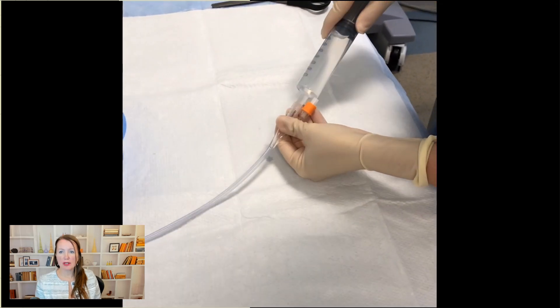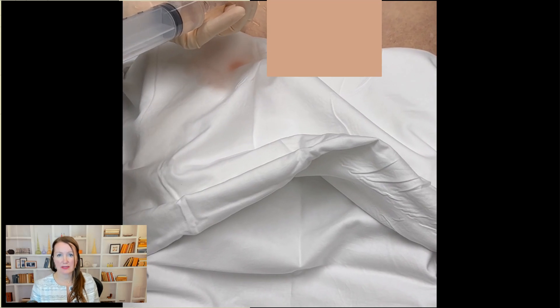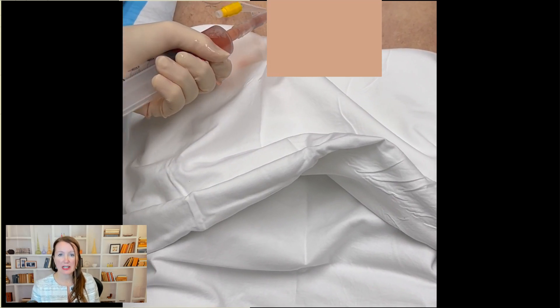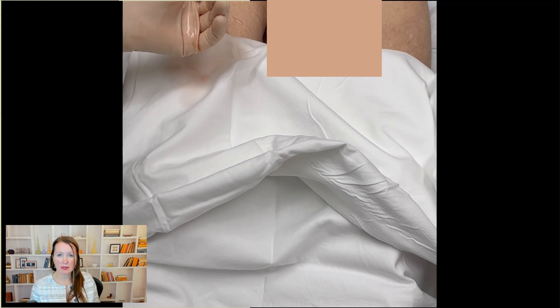To irrigate, sterile water or saline is placed in the syringe and used to fill the bladder. Pull back first to make sure the bladder is as empty as it can be, then push two fresh syringes of saline into the bladder, remove one, insert another, all with some turbulence in order to stir up the clots and remove them.